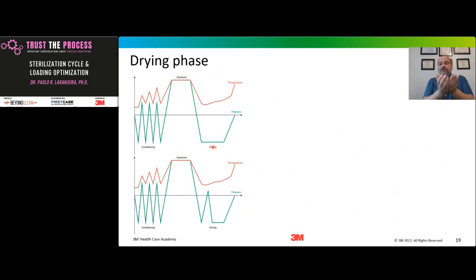So we need to have that temperature reaching the condensate to evaporate and then the vacuum pump to pull it out. By injecting a positive pulse, I will allow the temperature to reach that condensate inside of the chamber, and then when I do the vacuum again, that condensate has been warmed again, and in vacuum, when I pull it again, the pressure of vaporization is going to occur at a lower pressure, and then it is going to be removed from my load. So this solution is really a good solution.